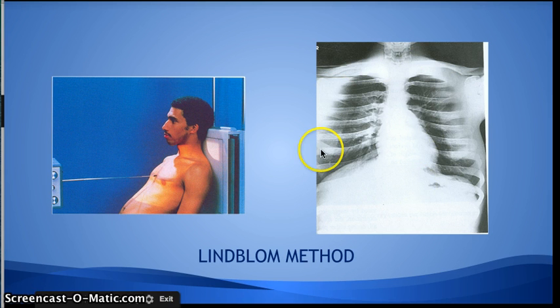If we look at our radiograph, we can see both lungs are demonstrated. Here's the heart shadow, but you notice the clavicles are kind of straight across the top of the patient's shoulders as opposed to angling down slightly like this, like they normally would. This is to demonstrate, as previously mentioned, the apices of the lung, which are normally obscured by those clavicles.